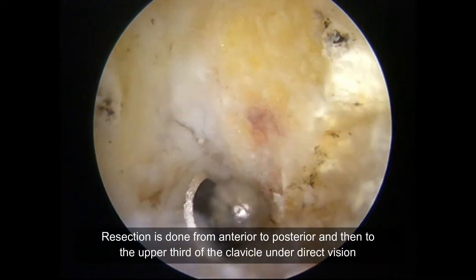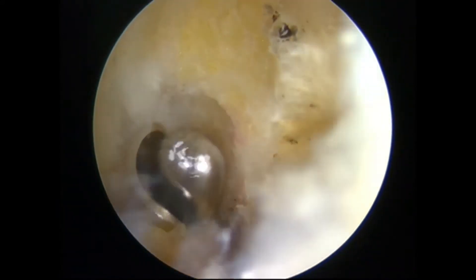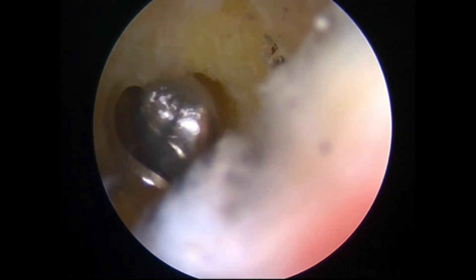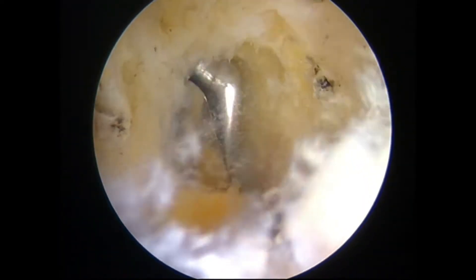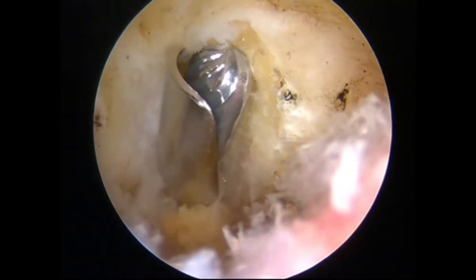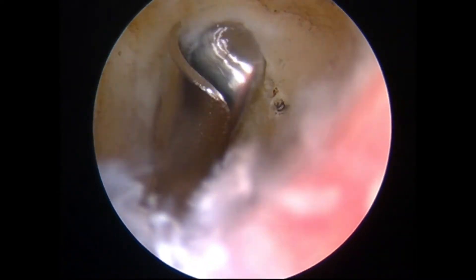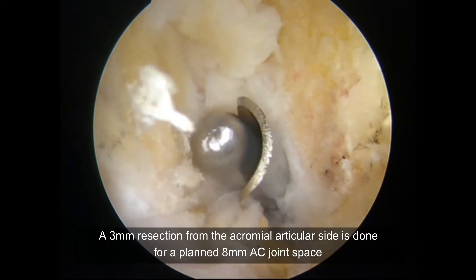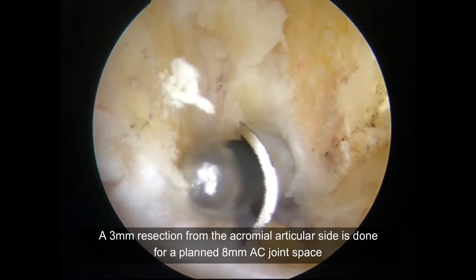Resection is carried out from anterior to posterior and then extended to the upper third of the clavicle under direct vision. As seen from the acromial articular side, resection is performed to achieve a planned 8mm AC joint space.